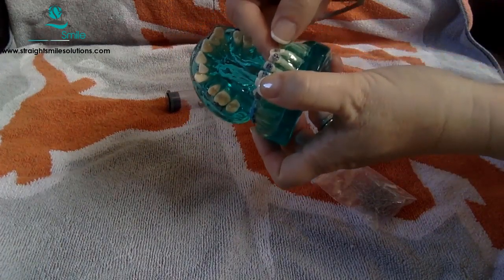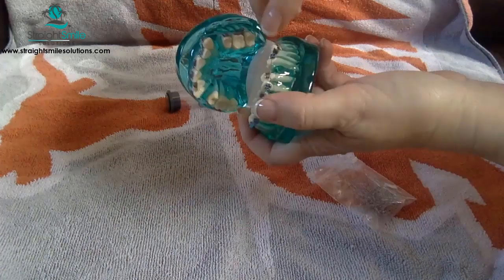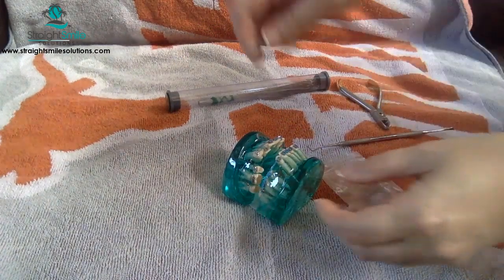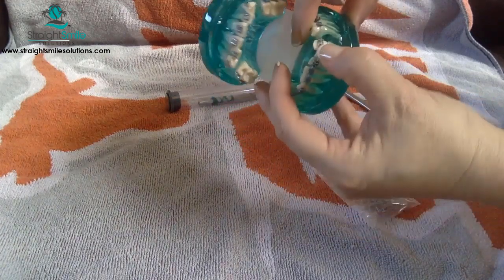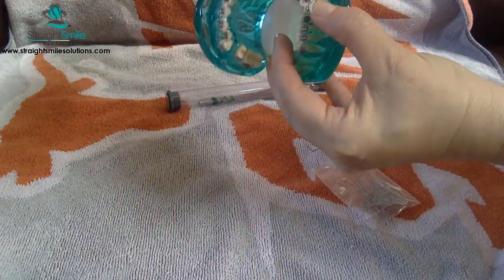Keep in mind I'm doing this leaning over and not on a patient, so it's a little more tricky. But what I do is I grab it, and then I bend the end a little bit in, just kind of curve it. That's just how I do it. And then I'm going to engage it either with my nail or with a ligature director. I don't know if you guys can see what I'm doing. This might be kind of tricky.